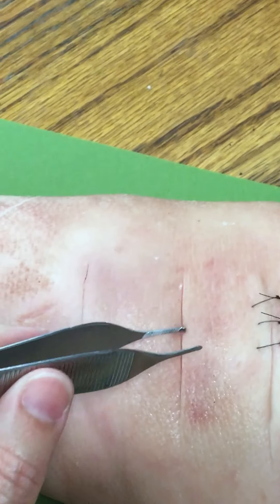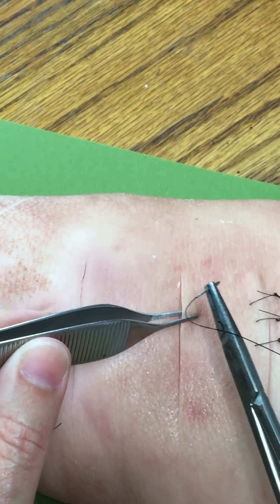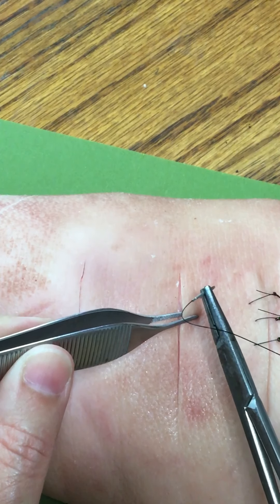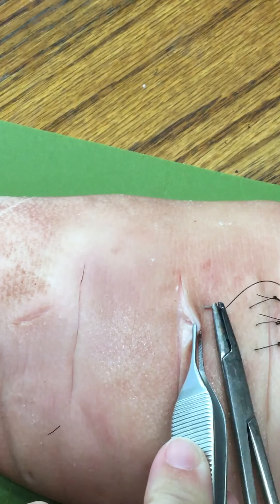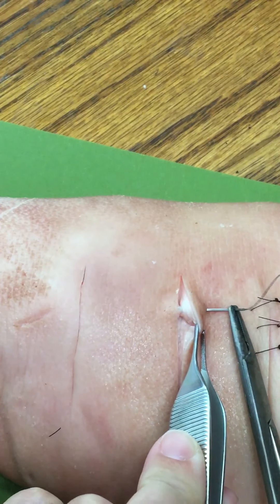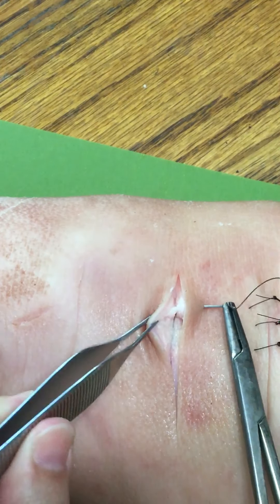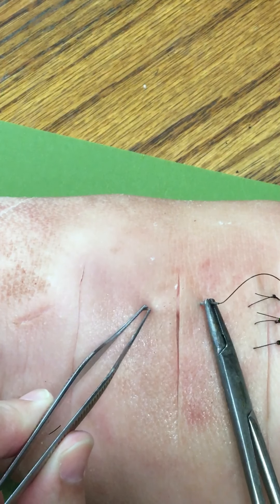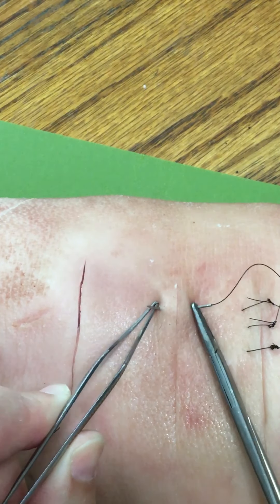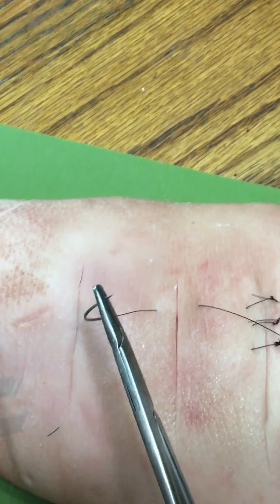Skin edges are well approximated to start with, so I'm going to enter at a 90 degree angle. You can see that I'm going deep on this side of the wound, the same depth on the opposite side of the wound, and coming out the same distance as my entry on the first side.